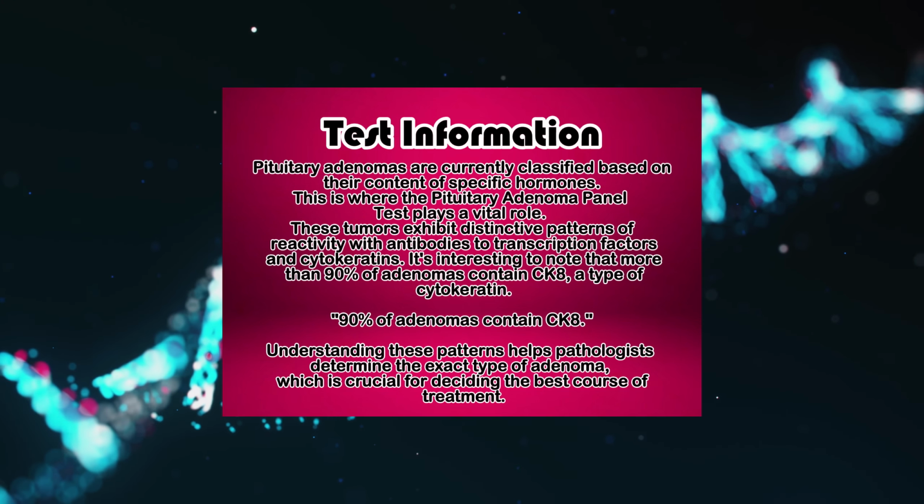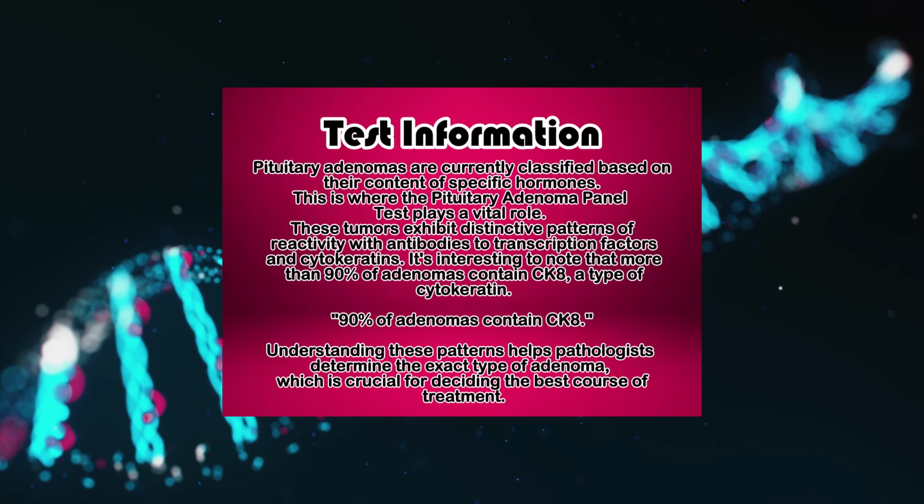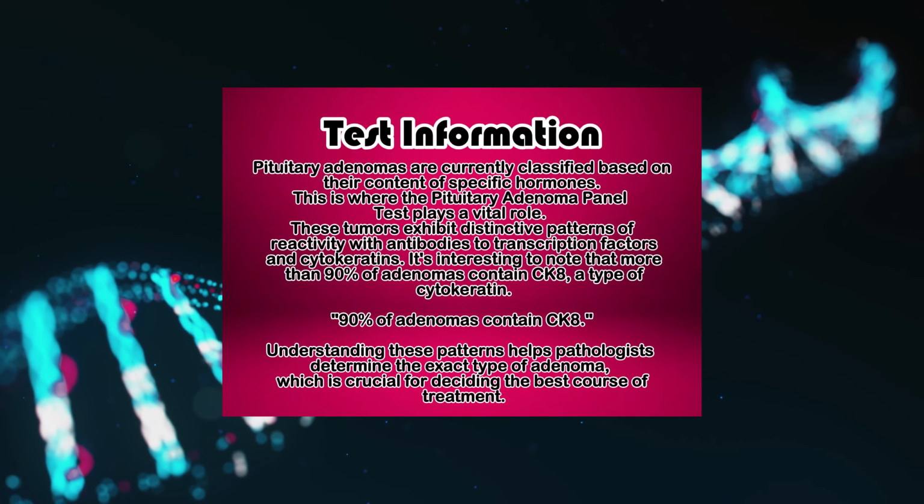Understanding these patterns helps pathologists determine the exact type of adenoma, which is crucial for deciding the best course of treatment.